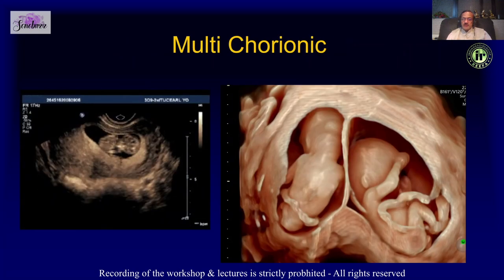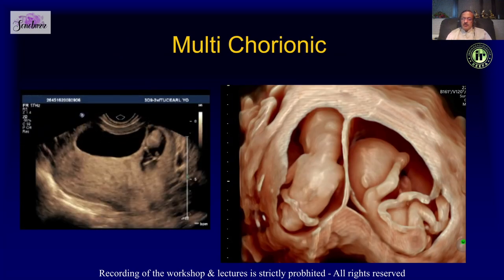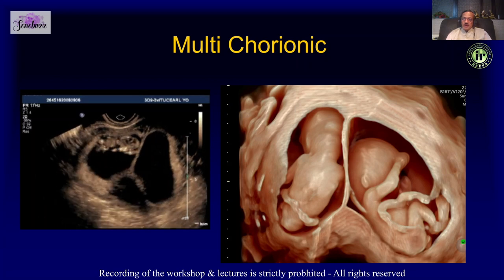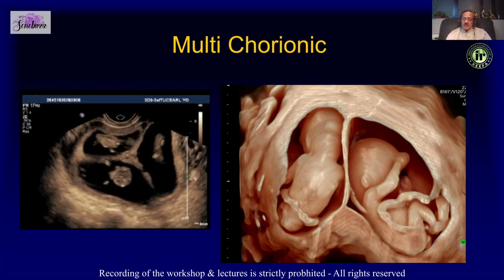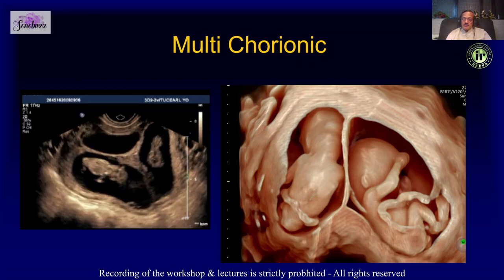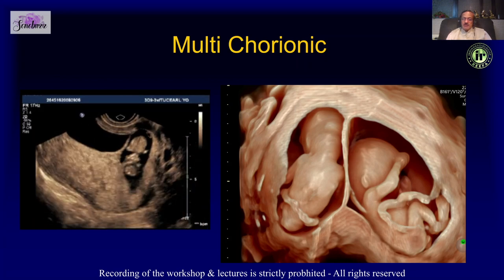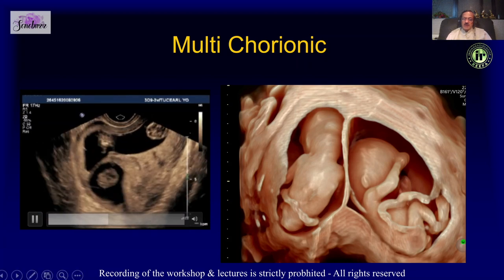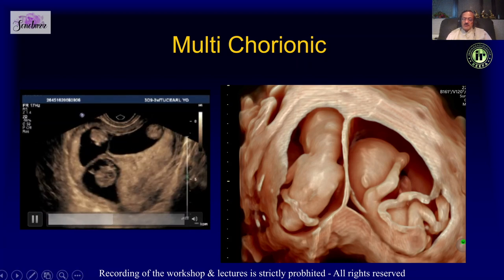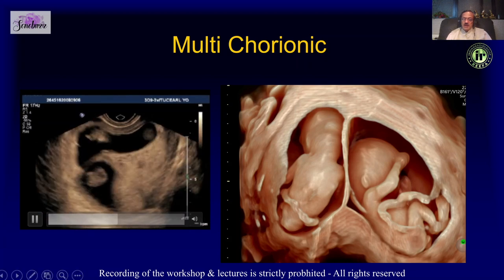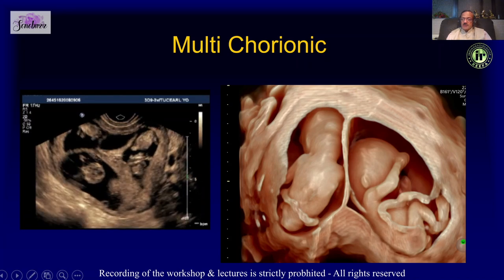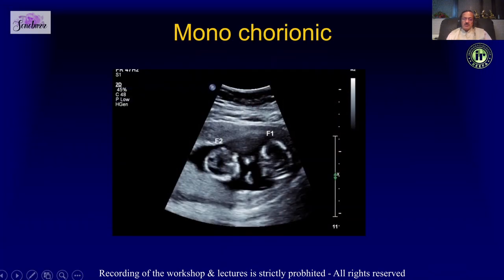Documenting chorionicity in your report is very important because it makes a lot of difference in management. Here is a trichorionic pregnancy, here is a dichorionic pregnancy where you can see the lambda sign, and as opposed to that here we have a monochorionic pregnancy.